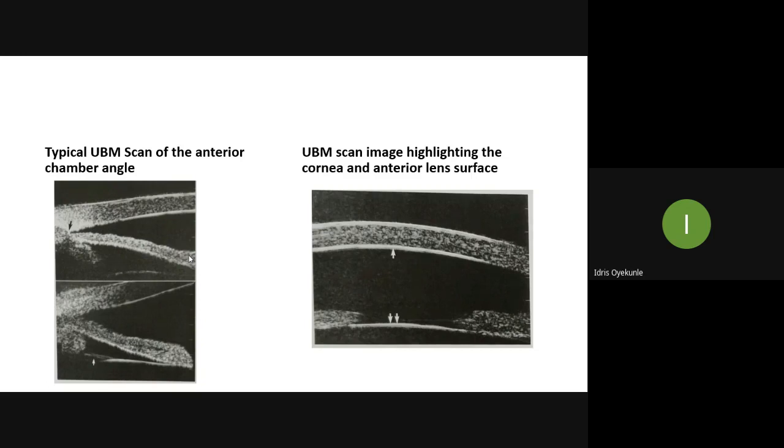But I'm not sure. I've not seen one before, so I don't know if it's really that common or if it's still being used, given the fact that we have some newer imaging modalities like the anterior segment OCTs. We'll leave that for discussion later.